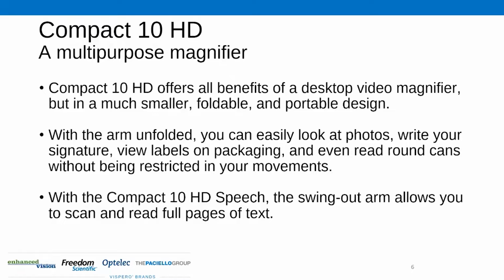One of the things I'll start by saying is when the engineering department first started to explore this type of device, and make no mistake, this for me is a very unique device in the way that we've gone about trying to accommodate the different requirements that someone might need a magnifier like this for, around the house, quickly spot reading some mail, a thermometer, but also maybe a newspaper article, looking across the room, maybe reading an extended newspaper article or recipes and things of that nature.